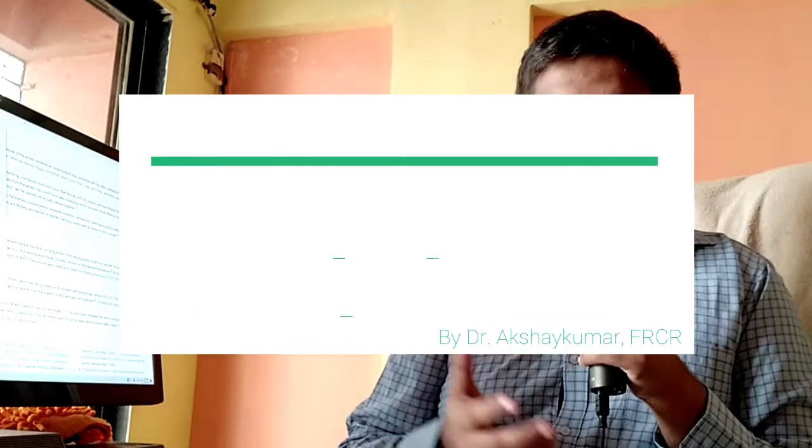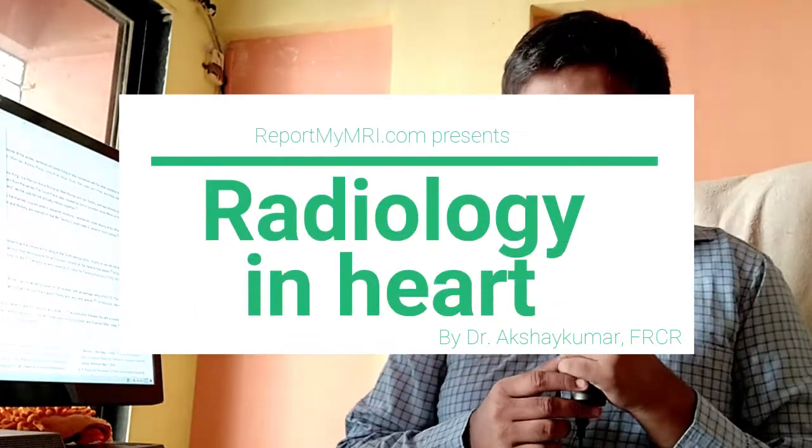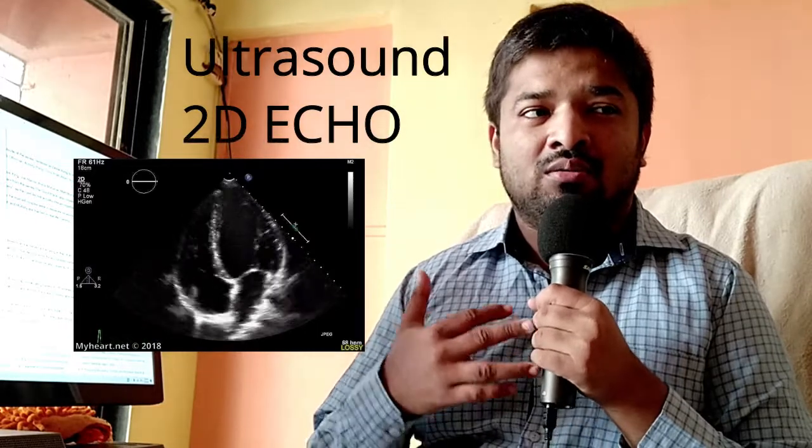To discuss heart diseases, we are going to look at what modalities can possibly be used when we are thinking about how to screen patients with heart disease. First, we have ultrasound, obviously, with 2D echo. So we will know how much ejection fraction there is, how well the heart is working, and whether there is a cardiomyopathy going on.